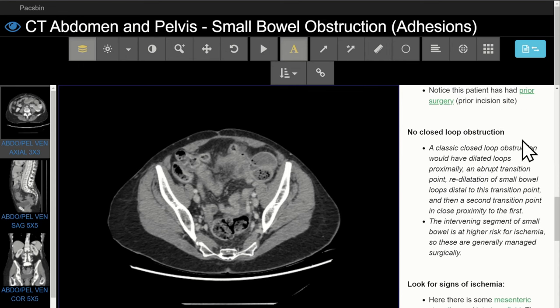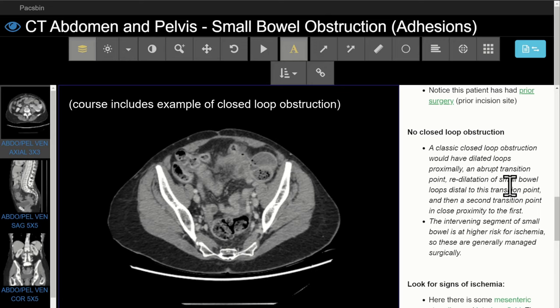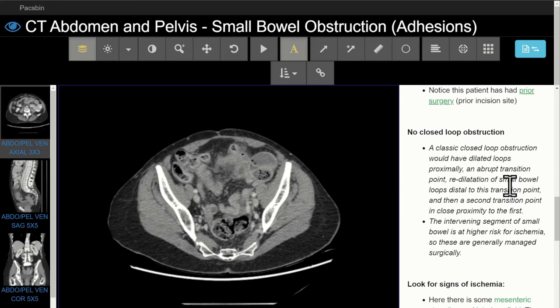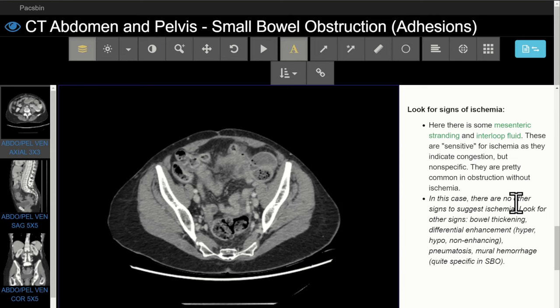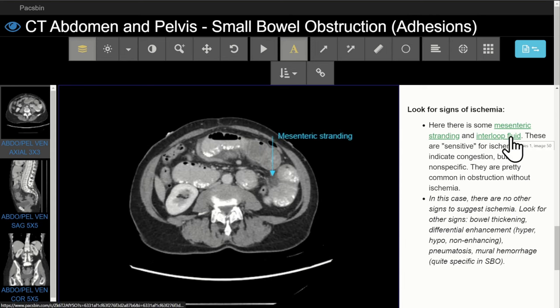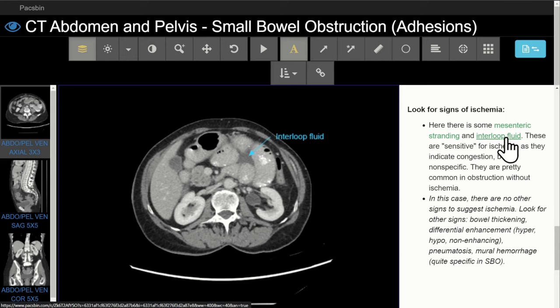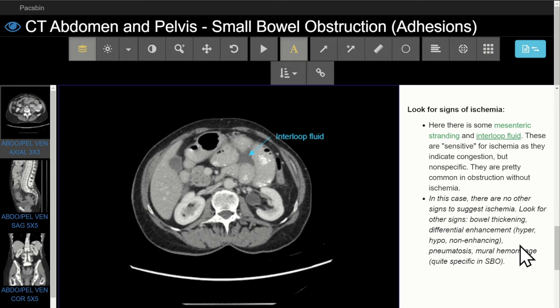Question three is: is there a closed loop small bowel obstruction? Classically, you're going to see dilated loops of small bowel, an abrupt transition point proximally, redilatation of that small bowel, and then a second abrupt transition point in close proximity to the first. Here there is no closed loop obstruction. Lastly, we look for signs of ischemia — there is some mesenteric stranding and some interloop fluid, but no specific late signs of ischemia in this case. We cover findings of ischemia in more detail in cases of bowel ischemia and infarction elsewhere in the course.